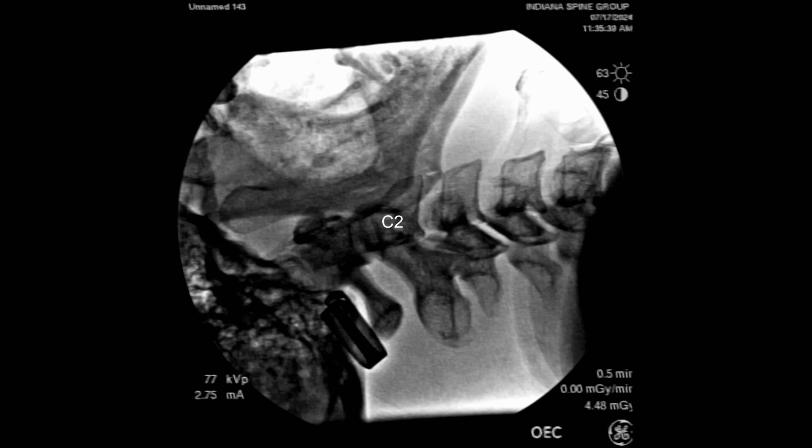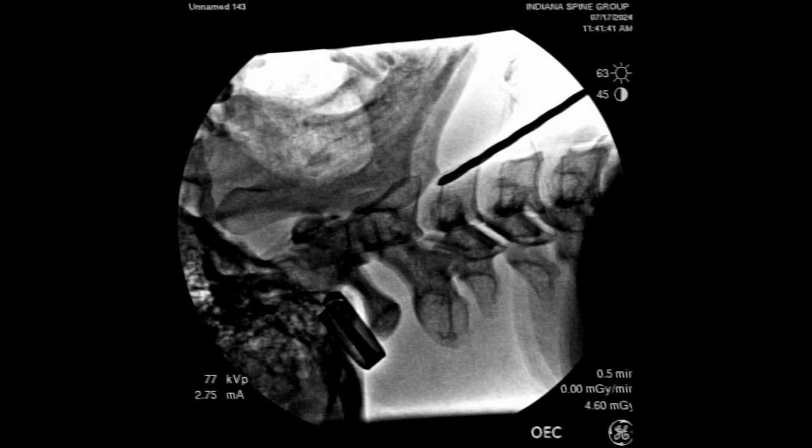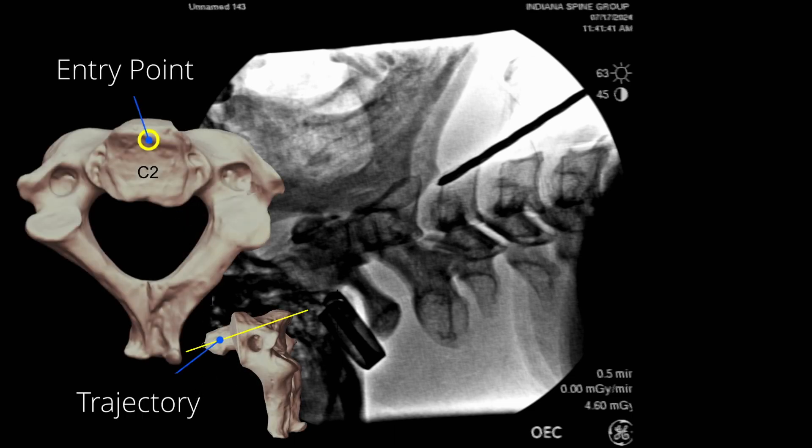We're also going to get a perfect lateral image of C2 and use an instrument external to the patient to ensure correct trajectory. I'm holding an instrument showing the trajectory — my hand is completely resting on the patient's chest, which is the typical trajectory, knowing we can get a screw in at this angle right beneath the lip of C2. Now that we have all of this done, we can start our procedure.